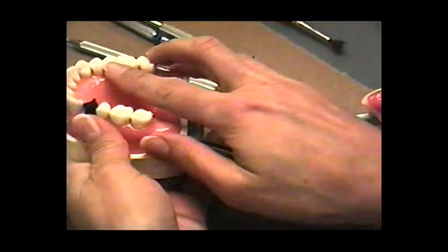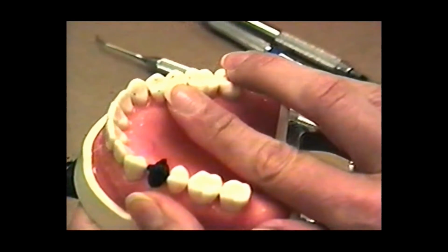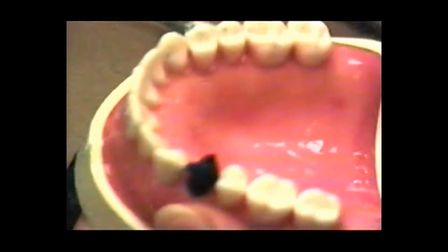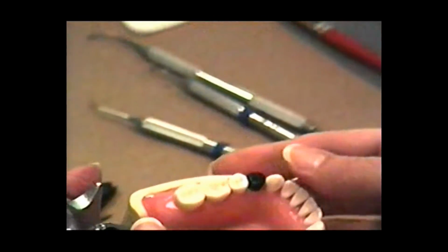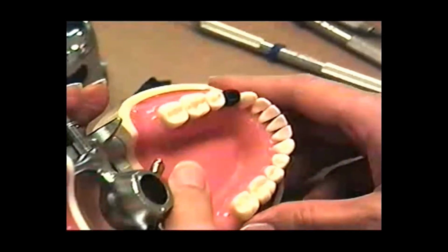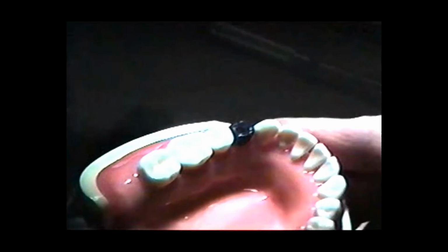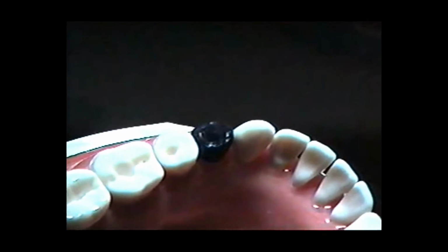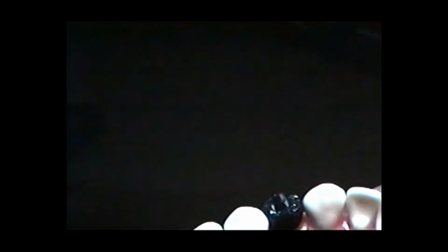Here we go. You can see I'm marking right here. I'm picking up wax from there, so now I know that I'm pretty close to where I need to be on my occlusion. At this point, the tooth is not screwed in, and this is just a word of caution to you. If you're developing your final anatomy and your occlusion, you need to make sure that your tooth is screwed in, because as you screw it in, it lowers the tooth a little bit.